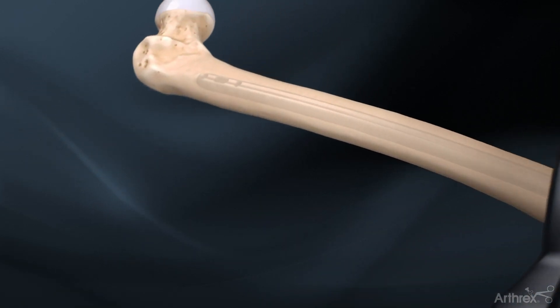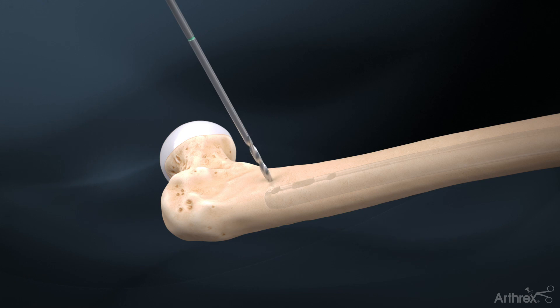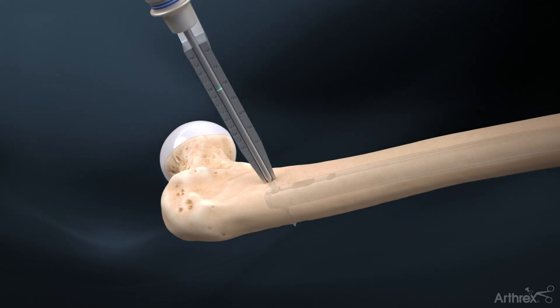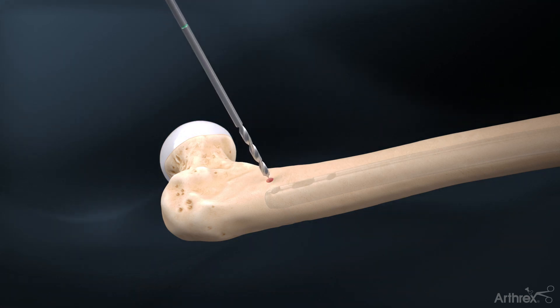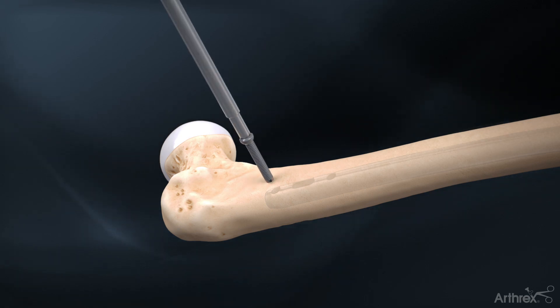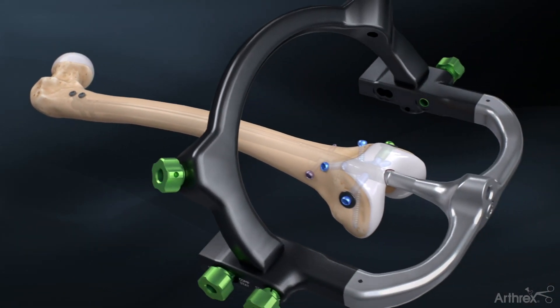For proximal fixation, use the drill sleeve to drill bicortically using a perfect circle technique. Screw length is measured using a measuring sled reading off the green stripe; a standard depth gauge may also be used. Insert a 5.0 mm screw using the short hex driver, and repeat the process twice to insert another two adjacent 5.0 mm cortical screws.